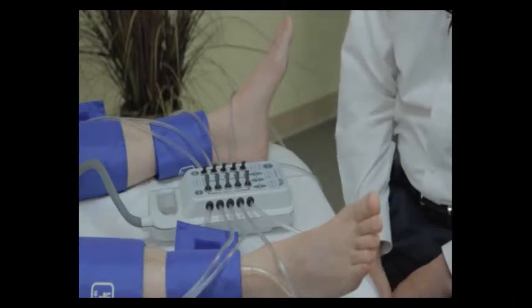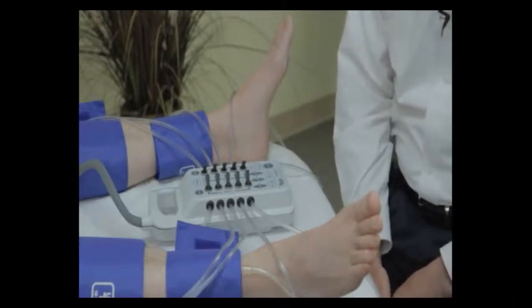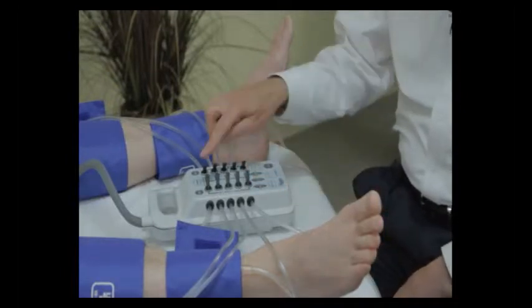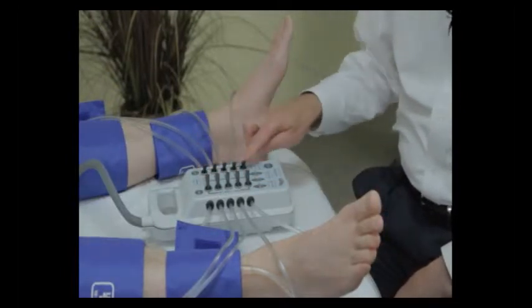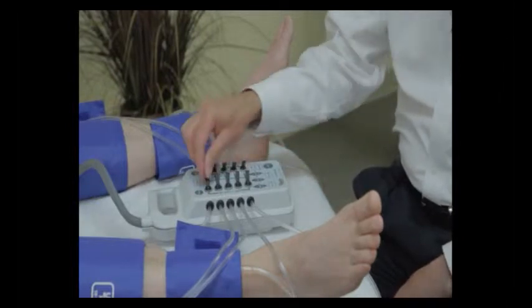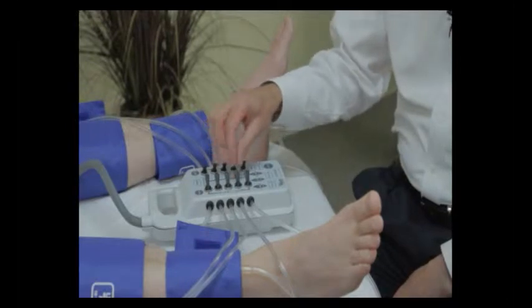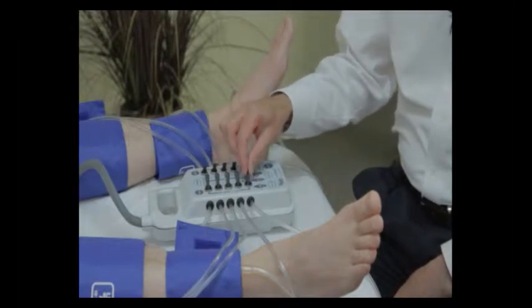This video is going to show you how to operate your Multilab 2 CPR multiple cuff selector. This has valves on it, five on each side, for the arm cuff, high thigh cuff, above knee cuff, calf cuff, and ankle cuff.